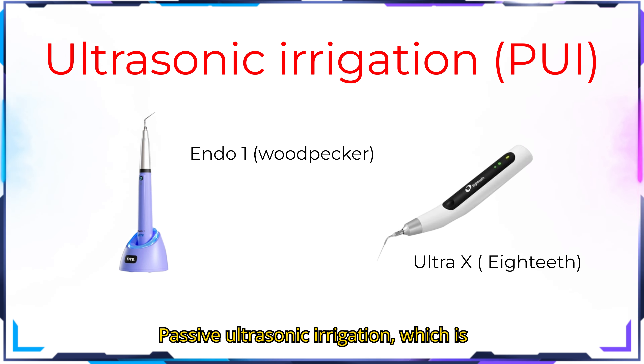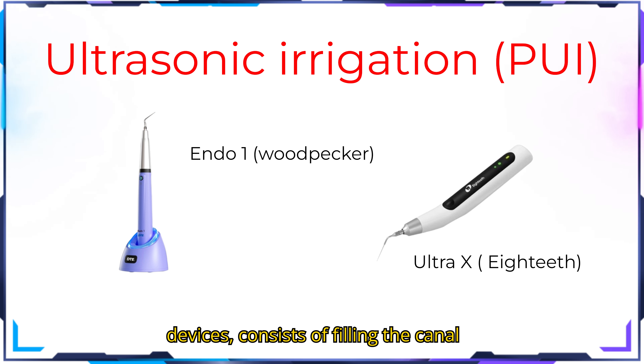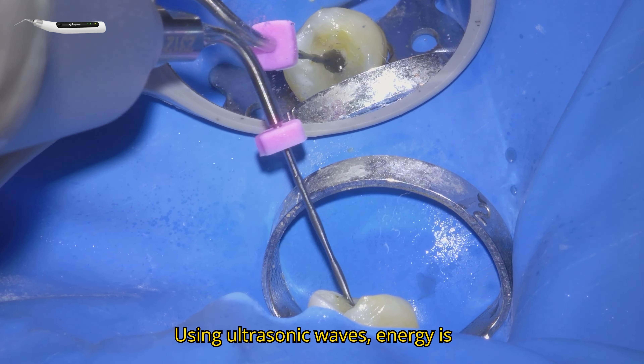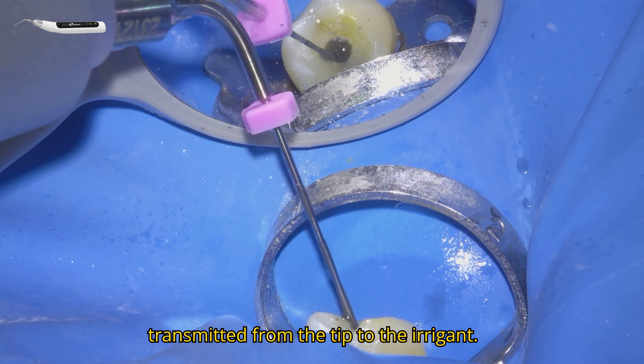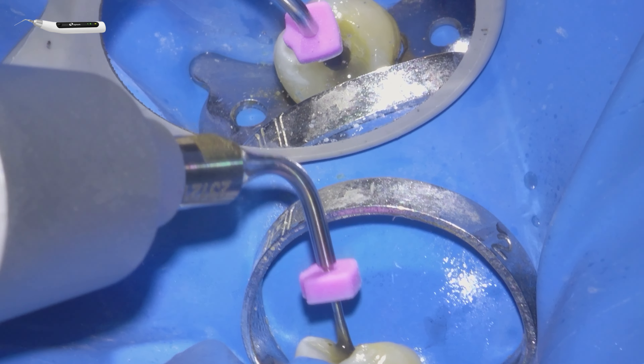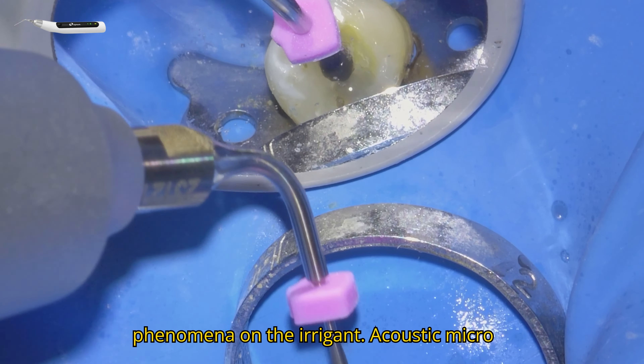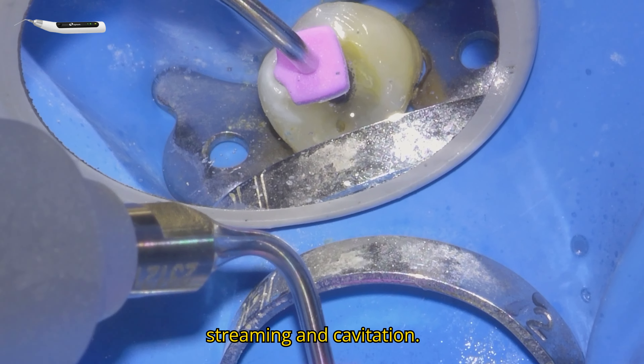Passive ultrasonic irrigation, which is what we perform with these wireless devices, consists of filling the canal with irrigant and activating the device. Using ultrasonic waves, energy is transmitted from the tip to the irrigant. Ultrasonic irrigation generates two phenomena on the irrigant: acoustic microstreaming and cavitation.